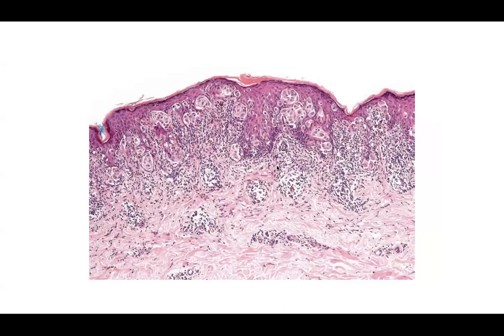Now, let's say that you didn't have clinical information, or you wanted to make sure that you weren't dealing with another type of pagetoid entity. You'll want to definitely make sure that you're not dealing with a pagetoid squamous cell by doing a P40 or a P63. You'll want to make sure that these are truly SOX10 positive and PRAME positive. I find it useful to get a PRAME just to understand which melanomas are PRAME positive or PRAME negative for future prognostication.